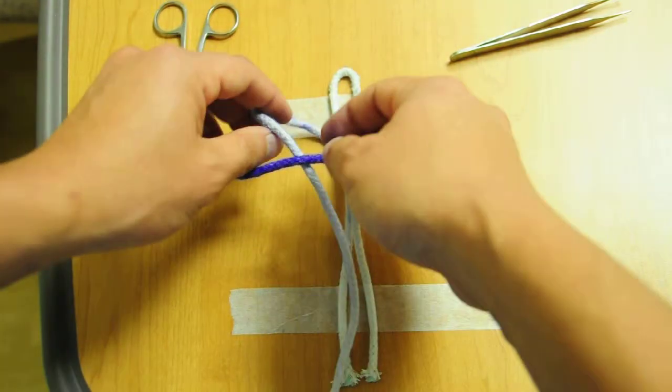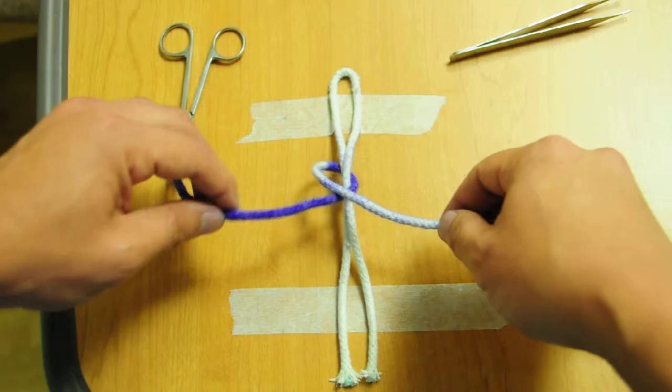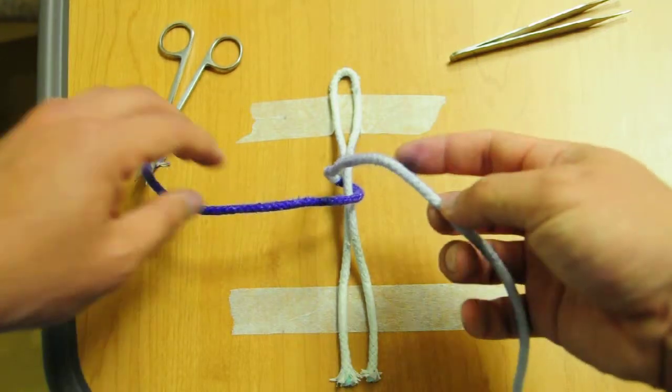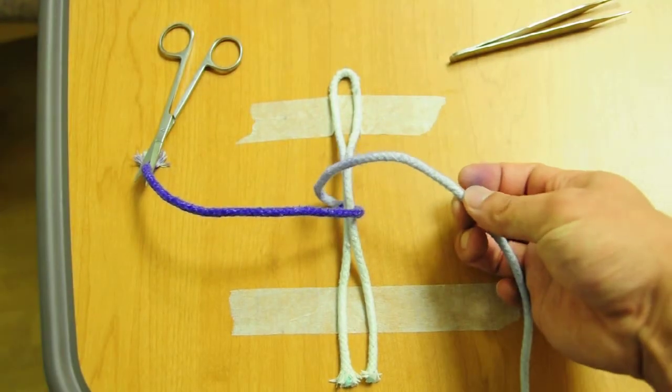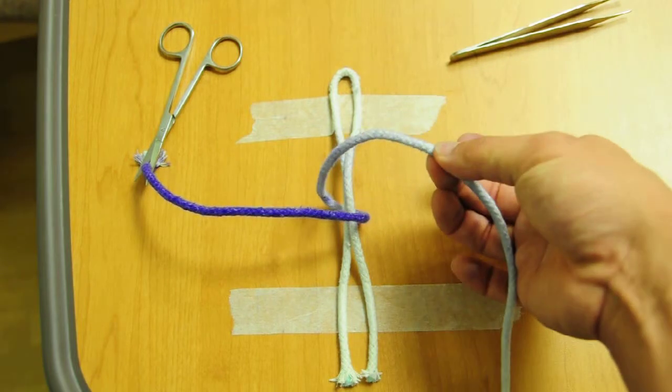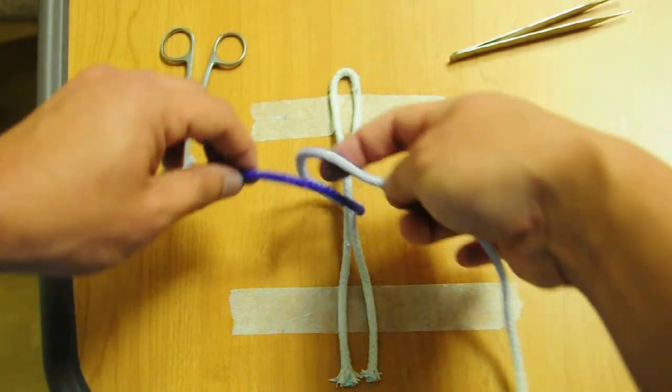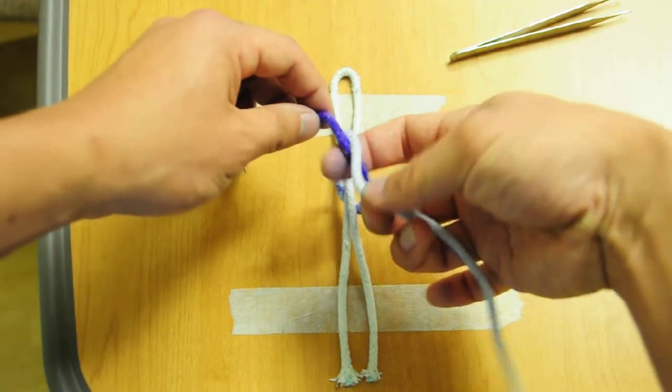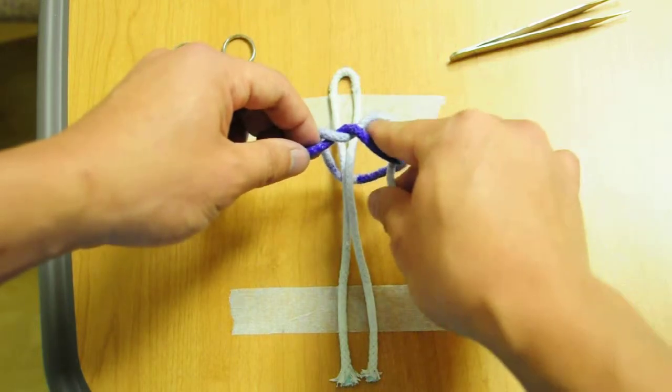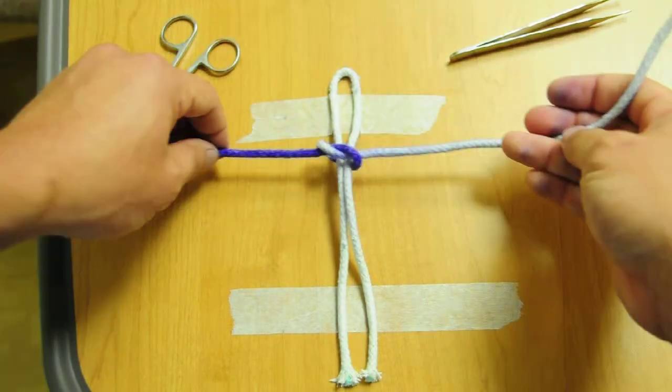Let's say you're starting over. You're going to do an index finger one-handed tie. When you're doing index one-handed ties, hold the suture with your middle finger and your thumb. You make the loop over your index finger. Your index finger has to pull the knot through. Cinch it down.